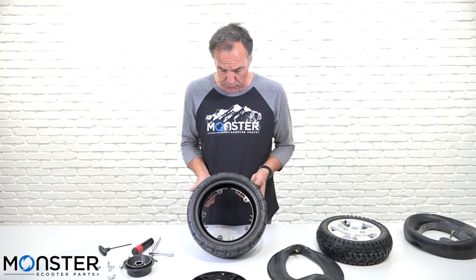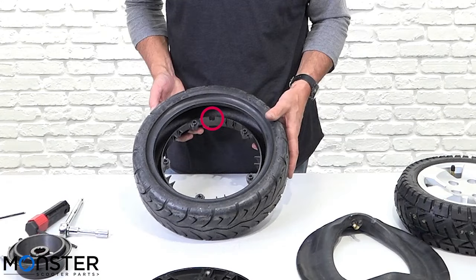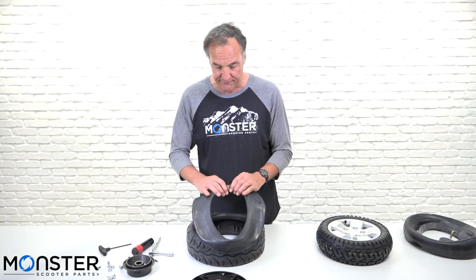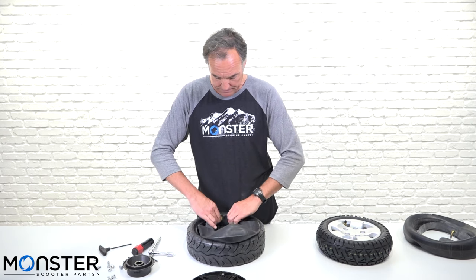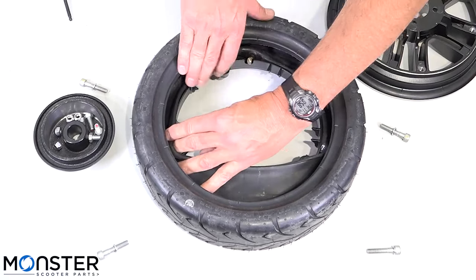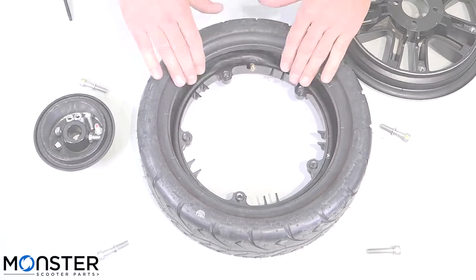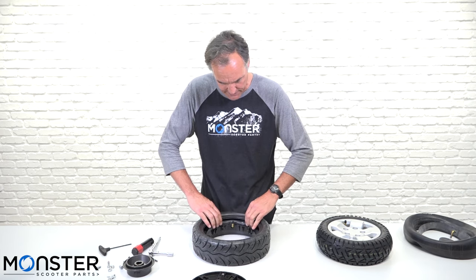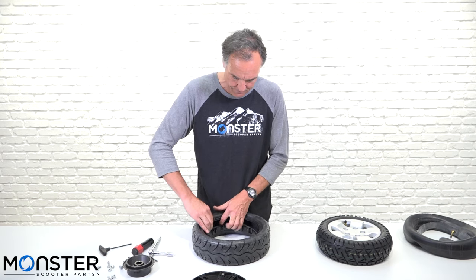Here's our rim that we're going to install the tube back on. You want to make sure you see this little groove in the rim that the valve stem is going to sit on. The valve stem is going to be pointing up so it's oriented correctly on the right side of the rim. It sometimes helps to have a little bit of air in the tube — it helps it sit down below the lip of the rim so you don't split it when you put the rim back together. Tuck it down in there and just make sure it's not hanging over the lip of the rim.